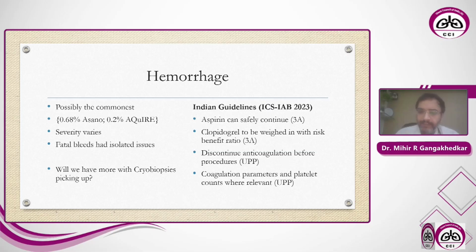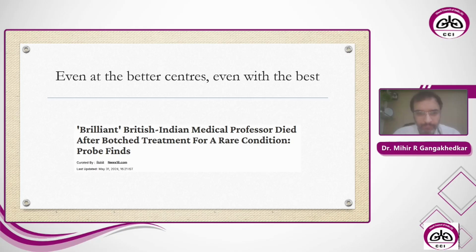And while platelet counts and coagulation parameters need not be done in all, is what the guideline says, it's rare, possibly in real life, for you to have a patient without these parameters before the procedure. And this was just 2 years back, where one of an Indian heritage professor in HLH, who had HLH himself, actually passed away after an EBUS in the UK itself, with bleeding, hemorrhagic complications. And so this can occur, and this can happen to practically anyone.